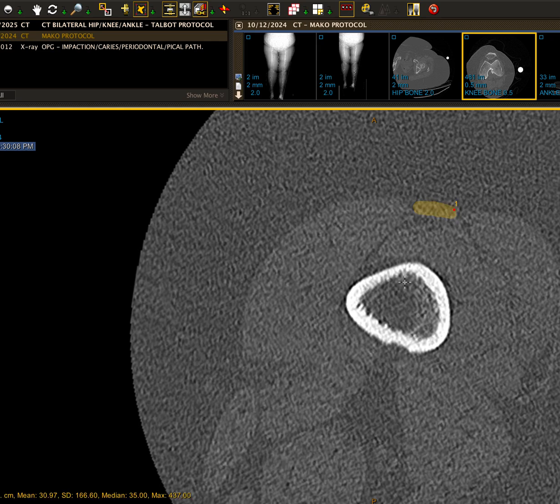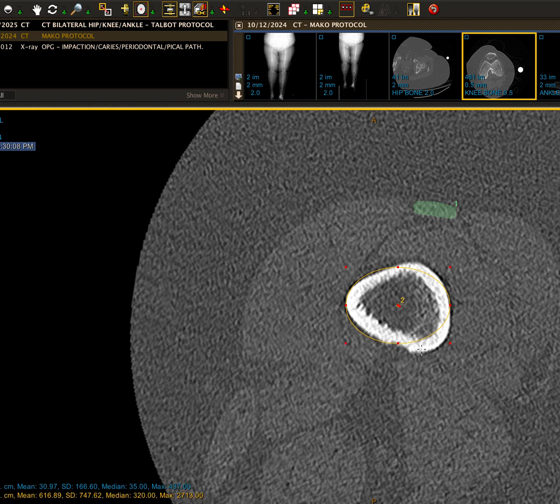We want to measure from the proximal end of the quads tendon to the centre of the femoral shaft. To do that, go to the circular measurement tool and find the centre of the femoral shaft — mark the lateral edge, bring the oval across to the most medial edge, and adjust until you have the best approximation of the centre of the femoral shaft.